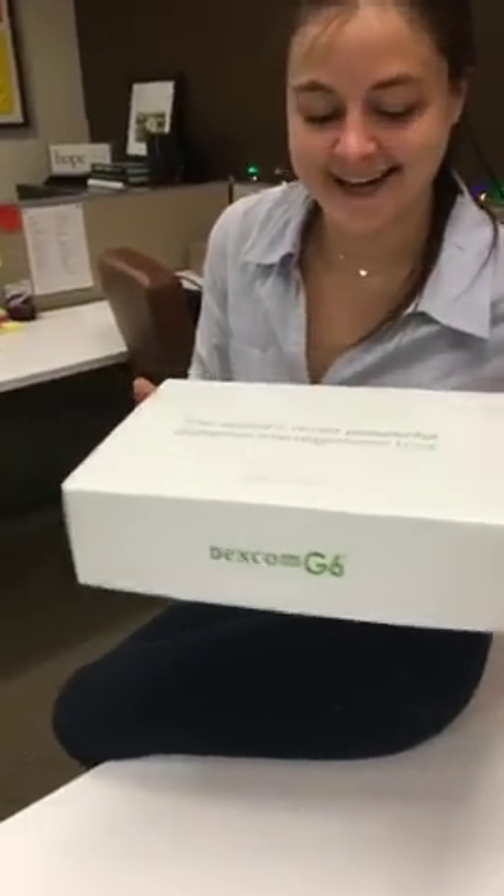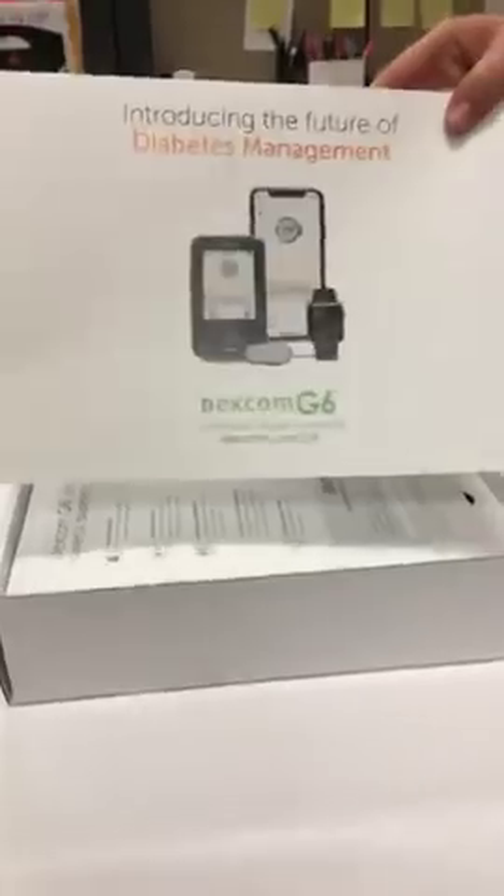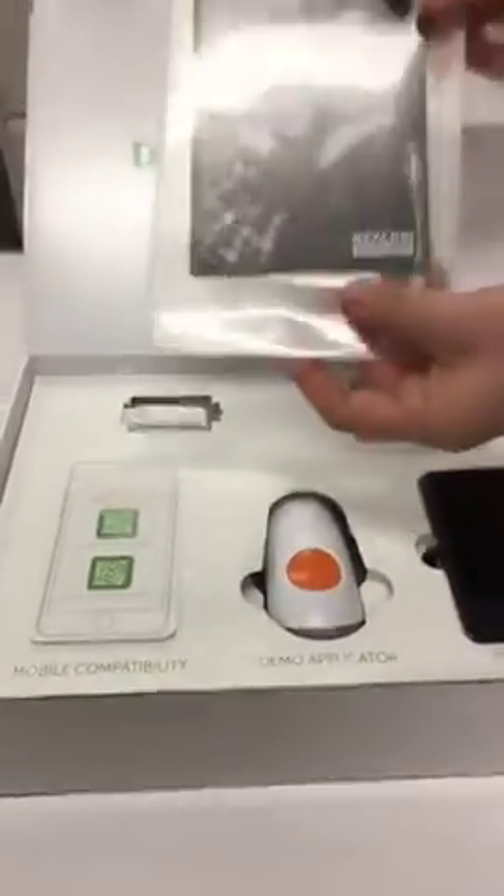We just got the Dexcom G6 demo kit in the Beyond Type One office! We're so excited to see what this looks like. The Dexcom G6 was just FDA approved — there are a ton of awesome new features and we're super excited to show you guys. The news came out yesterday that the G6 is FDA approved, so we are really lucky to have a first look. This is not a working G6, but it is a demo, and we wanted to give you a look at what it looks like.